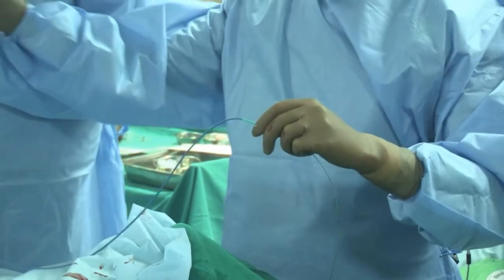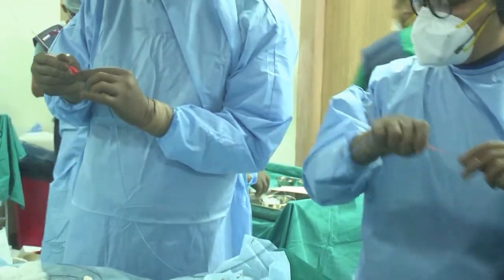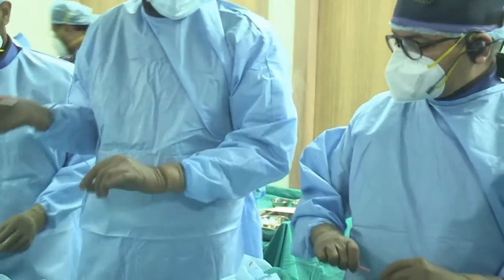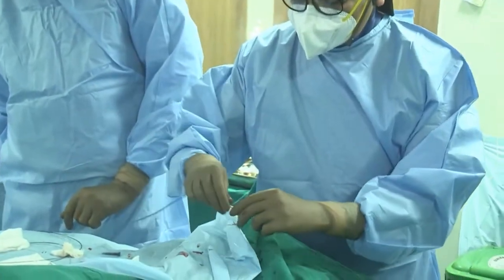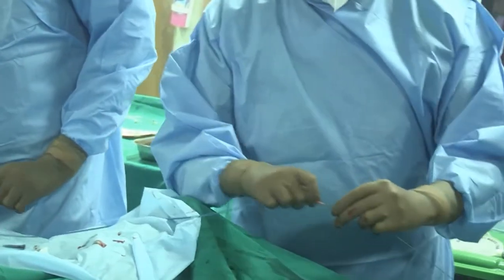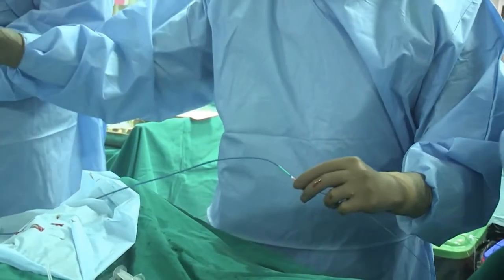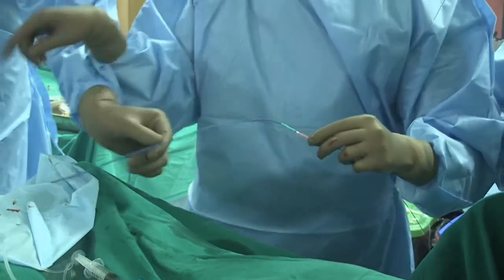Can you push a little bit? No. What we find, Rahul, as Pillai sir was mentioning, is that when you are doing it directly, not this ad hoc way, it is better to give a good nick there at the site, because sometimes over the wire, getting the bigger catheter in could be troublesome and the catheter could get damaged. Probably a good nick is important. Can you just push this?